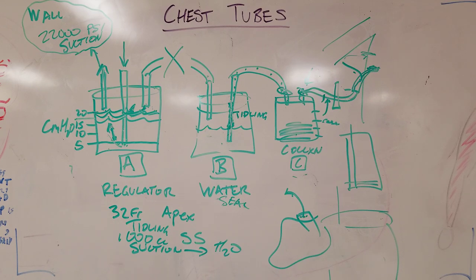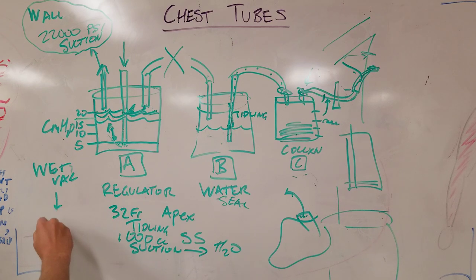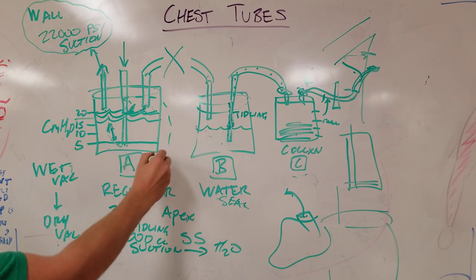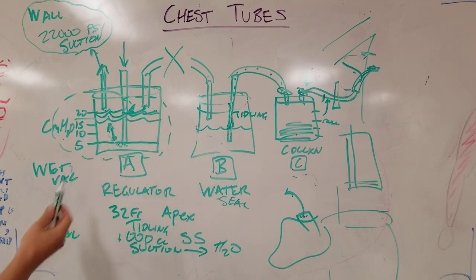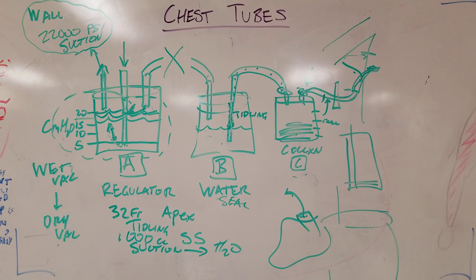The one thing to note is most places that I've been have switched from an actual wet vac to a dry vac. And all that means is the way they're accomplishing this regulator function is instead of using an actual column of water, they're using a piece of plastic that functions as a valve to create the regulator. But you don't need to know that. The only people you need to know that are people that make Oasis or Pleur-evac or whatever, whoever does that. Some other things to talk about.